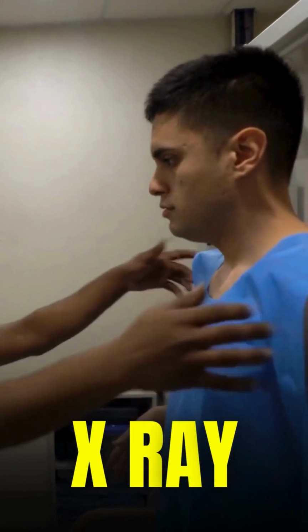The other indication is therapeutic, where we want to decompress the chest and take out a lot of fluid, which is about a maximum of 1.5 liters, or as much as is collected and gives the patient symptom relief. How do you assess post-procedure? A simple X-ray is done post-procedure and we see the re-expansion of the lung along with reduction of the volume of the pleural fluid.